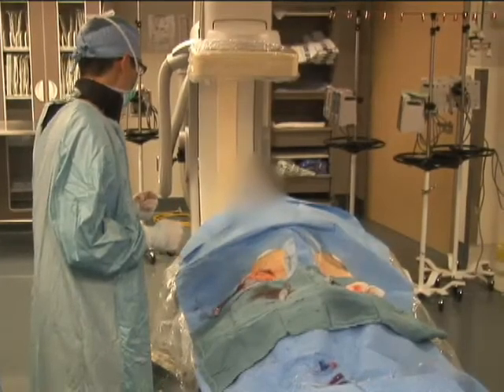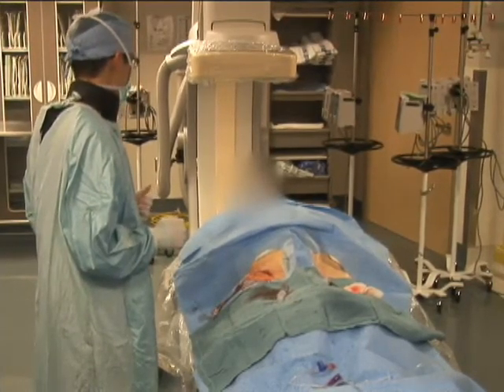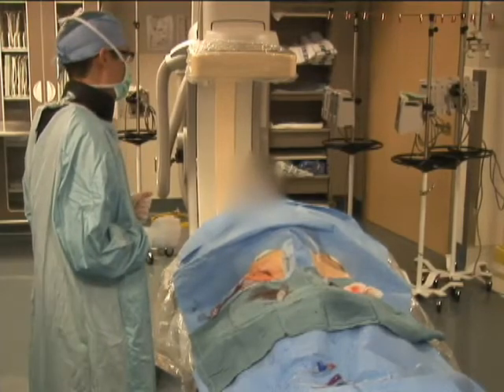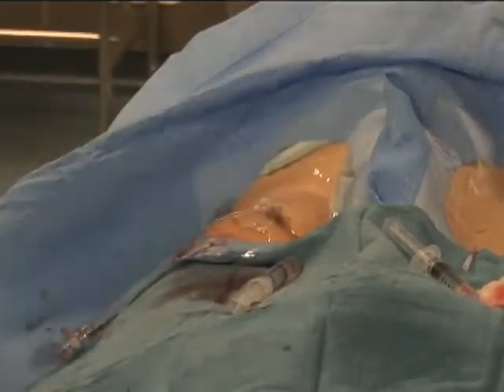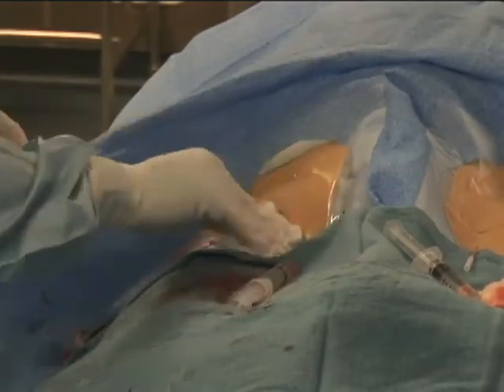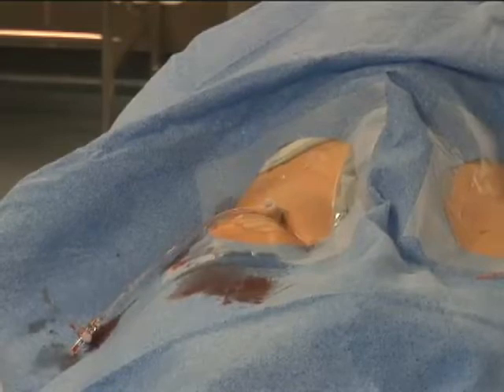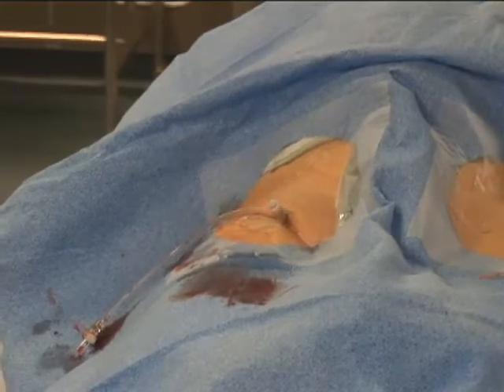After the study is complete, the vascular sheath is routinely sutured in place until the activated clotting time returns to baseline. Once the activated clotting time returns to baseline, the sheath is removed. During sheath removal, it is important to monitor the patient's vital signs closely, as vasovagal reactions manifesting as hypotension and/or bradycardia may occur. If hypotension is observed, this can typically be remedied by small boluses of IV fluid. If bradycardia is observed, this can typically be remedied by small doses of IV atropine.